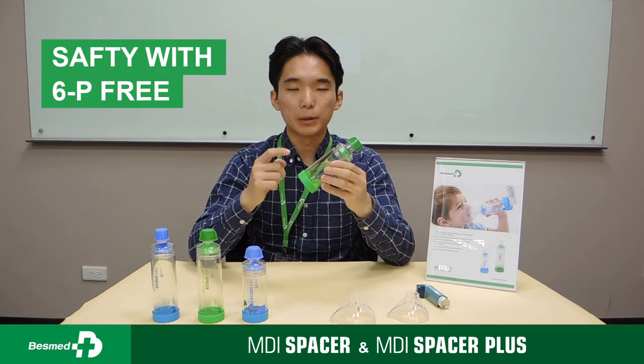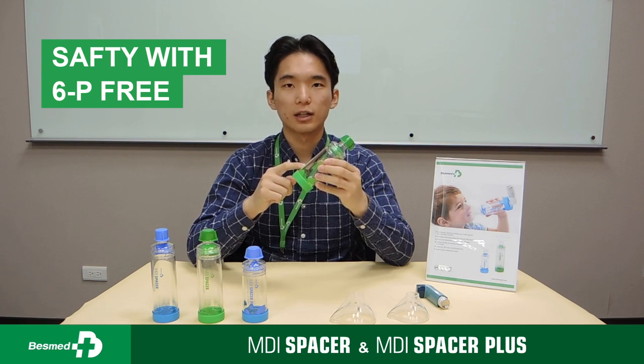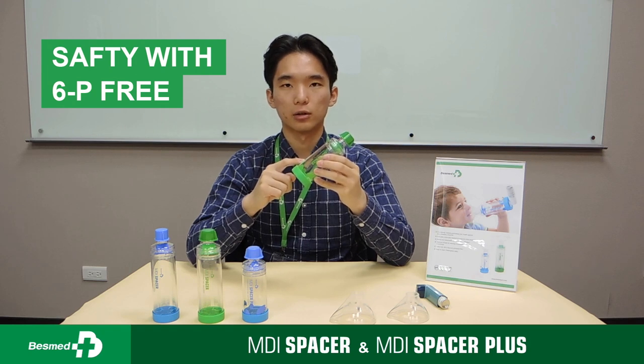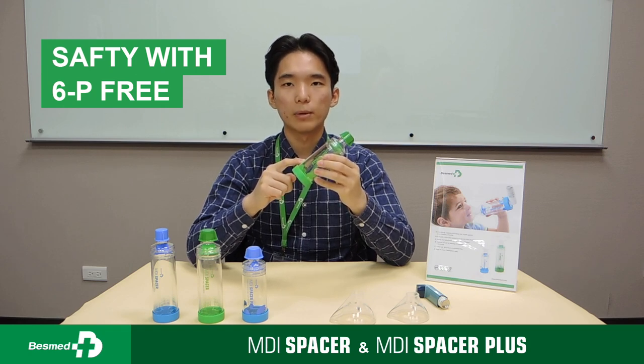Number four: our MDI Spacer is BPA-free, latex-free, and PST-free. Patients do not need to worry about inhaling unhealthy chemicals. As always, Bezmit puts our patient safety first.